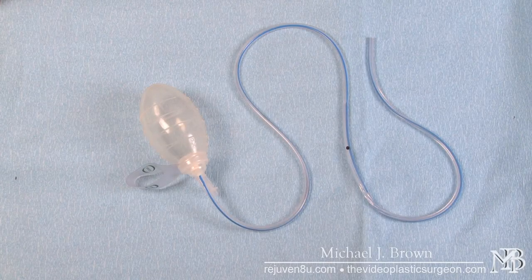This plastic surgery video goes over the use of a surgical drain called a Jackson Pratt drain. This drain is used to evacuate fluid from the inside of a wound.